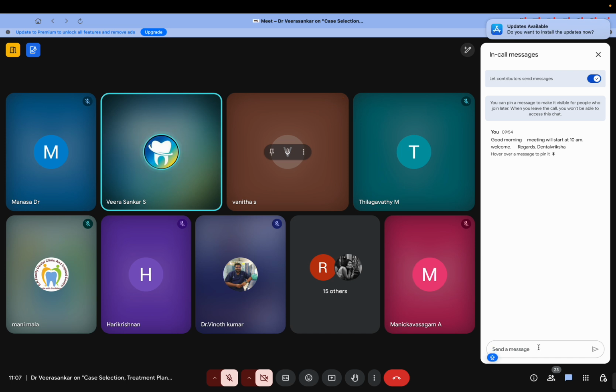Both are there. When it comes to anterior intrusion for deep bite correction, we take the premolars as an anchorage unit. We use attachments over the premolars, so that the premolars act as resistance and avoid the posterior extrusion, which is a side effect of anterior intrusion with conventional mechanics. That can be avoided by placing attachments on the premolar units. That will also help us go ahead with proper anterior intrusion. So sometimes the aligners act as force application. These attachments can be used to apply forces to the teeth along with the aligners, or sometimes used as an anchor unit to gain support.